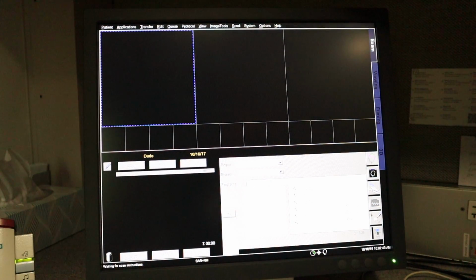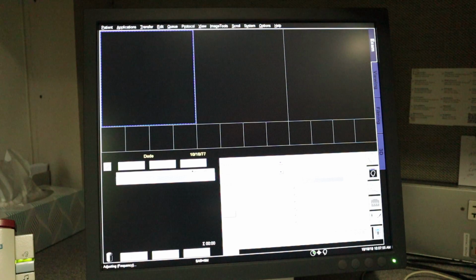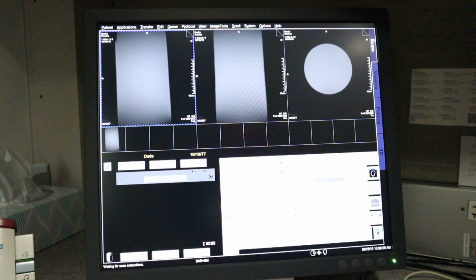Alright, so we're just going to run a real quick scout. Let's take a look here. See, again, it's adjusting the frequency, transmitter. Okay, so now we have our three views, our sagittal or coronal and our transverse or axial.